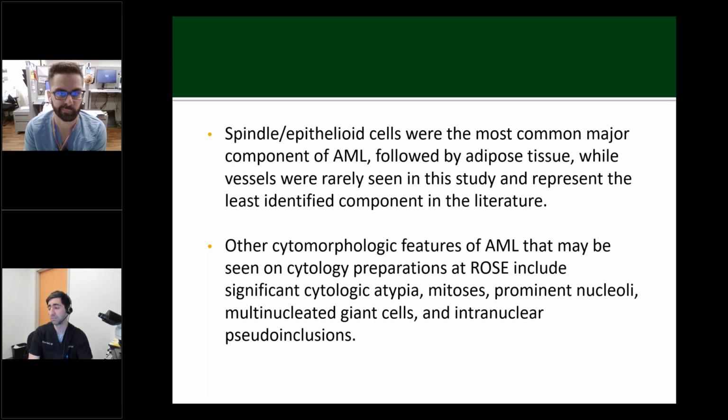Vessels are structurally sometimes hard to see during touch prep. In addition to the presence or absence of angiomyolipoma components, other cytomorphology features have been reported that may be seen on cytology preparation at ROSE. Significant cytologic atypia, mitosis, prominent nucleoli, and multinucleated giant cells have also been reported in these entities.